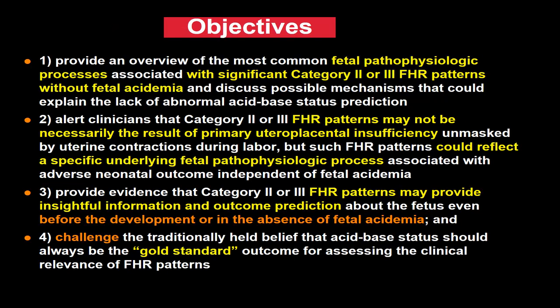However, after extensive clinical use of electronic fetal monitoring, it appears that there are certain fetal pathophysiological processes associated with significant Category 2 or Category 3 fetal heart rate patterns, even in the absence of fetal acidemia. The objectives of this video are: number 1, provide an overview of the most common fetal pathophysiologic processes associated with abnormal fetal heart rate patterns without fetal acidemia and discuss possible mechanisms.